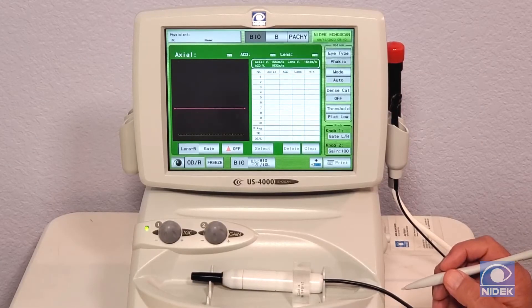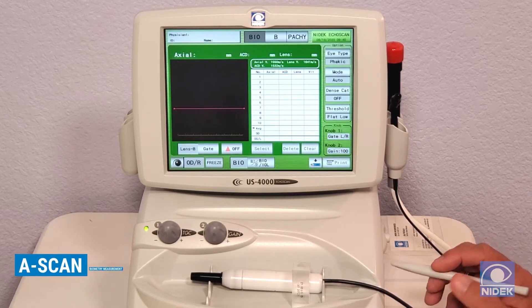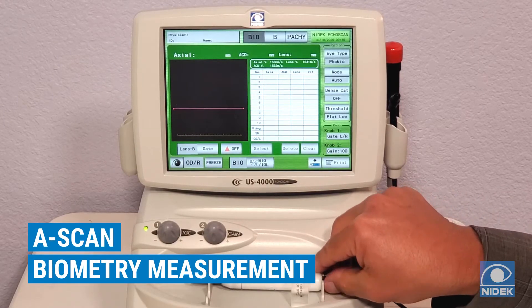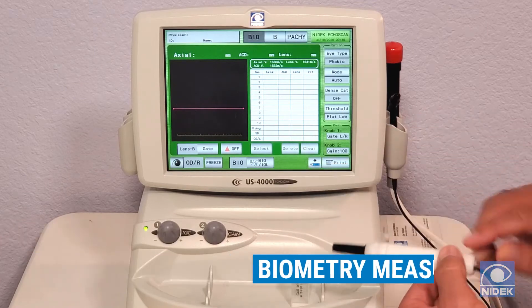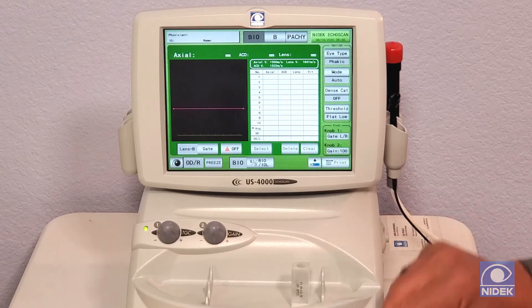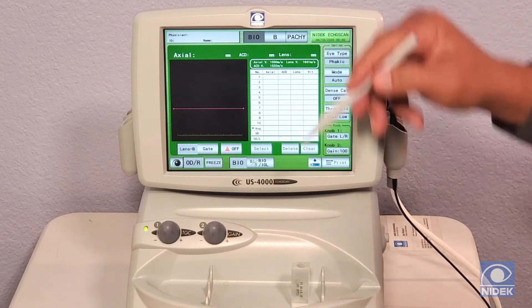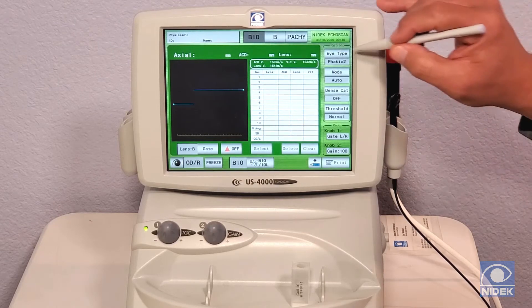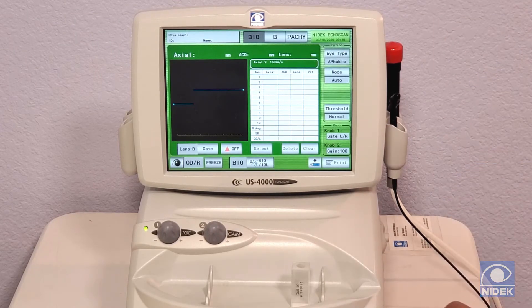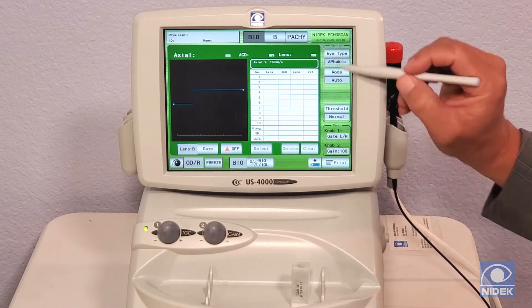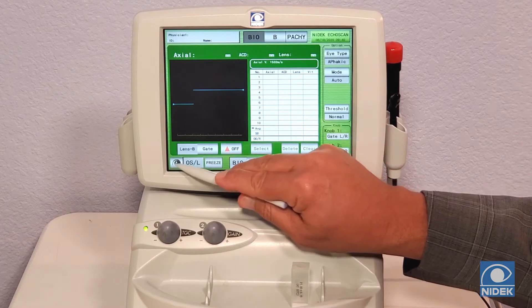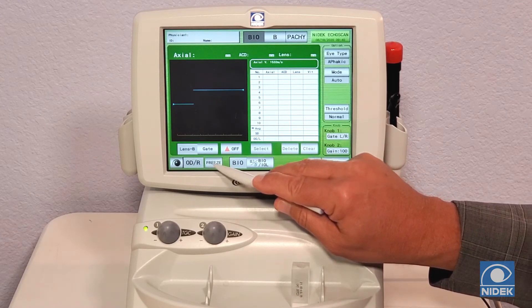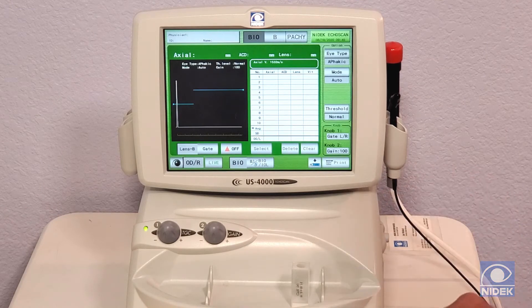Now I'm going to demonstrate how to take a measurement with our contact A-scan probe. I have a jig here with a little bit of water. Since this jig does not have a natural lens, I'm going to change the eye type to A-phakic. I'll come down, select the proper eye, and click on freeze to go live.